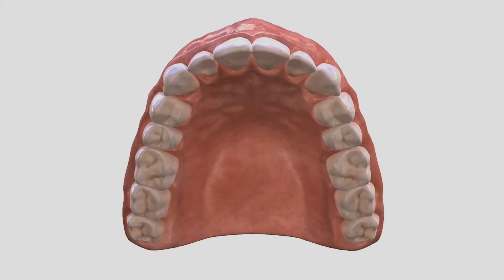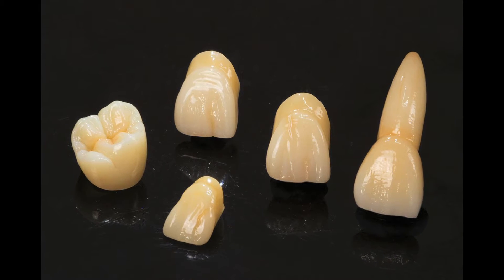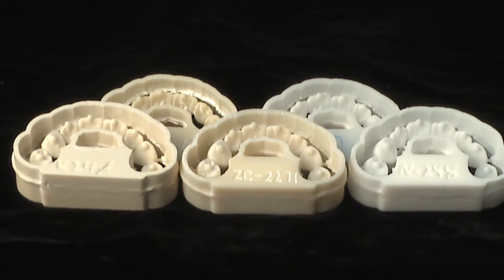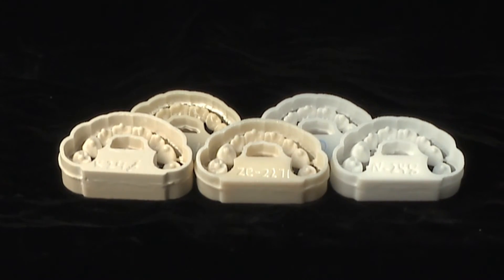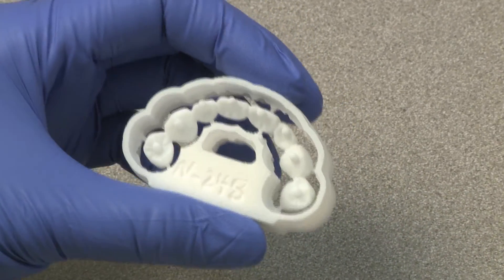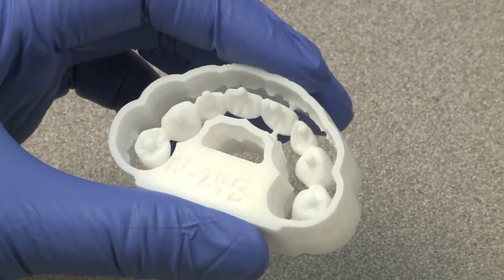The geometry of natural dentition is much more complex and we therefore need to test our processes on these shapes if we are to understand and minimise errors. To test the variables of the sintering process on complex structures like a bridge, we first need to be able to measure it. It is extremely difficult to accurately scan and compare the full bridge form, and so we need to create our own reference points that can be reliably located and measured both before and after sintering.